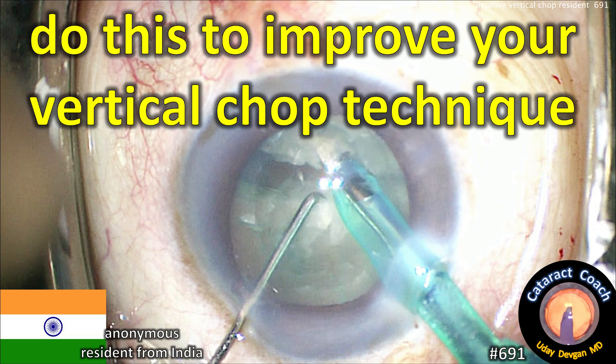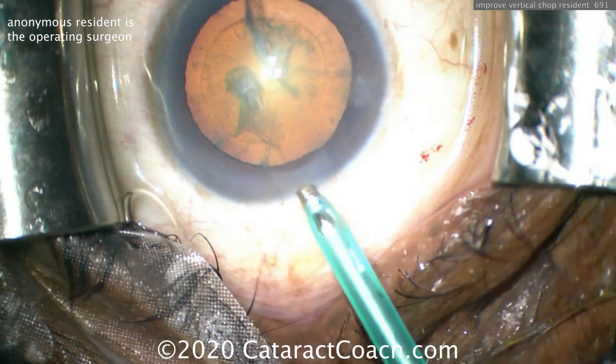CataractCoach.com. Do this to improve your vertical chop technique. We have a video from an anonymous resident in India. Let's watch the technique here.